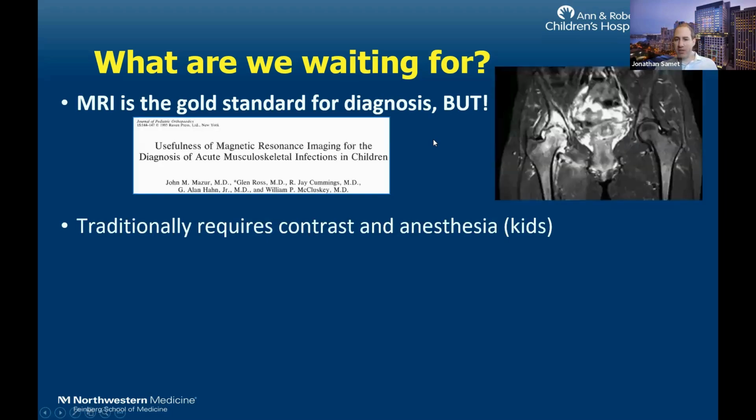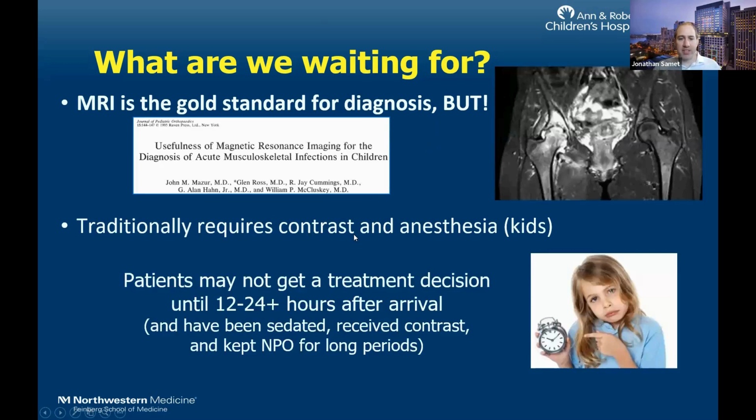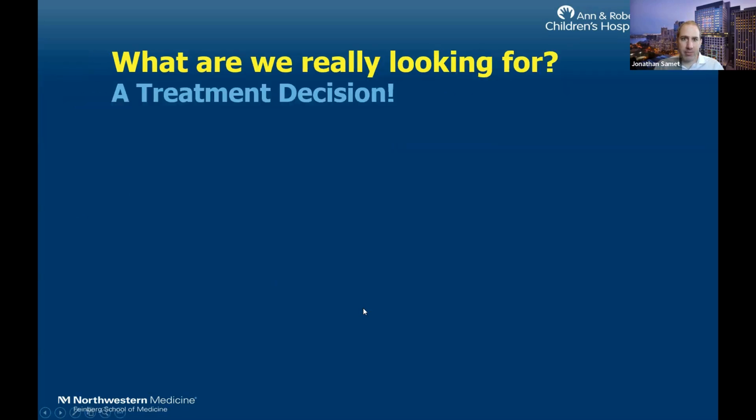But we know that it traditionally requires contrast and anesthesia. Patients may not get a treatment decision until 12 to 24 hours after arrival to the hospital. And they have to be sedated, receive contrast, and kept NPO for long periods of time.